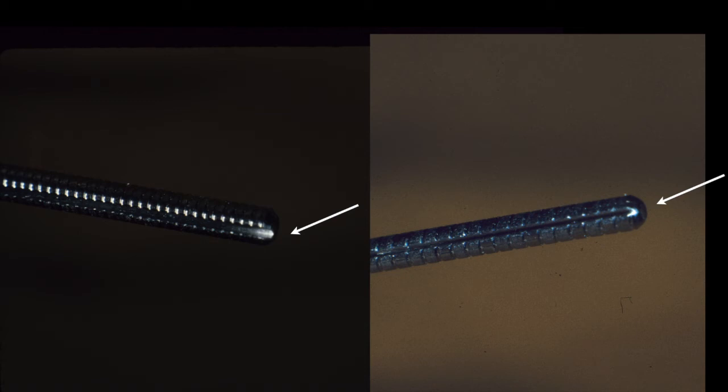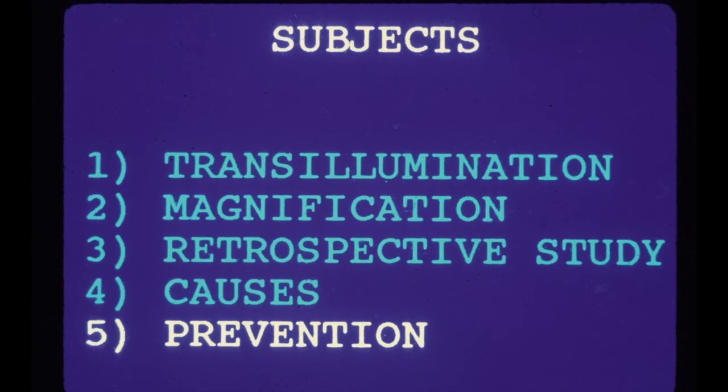When you press the post in gently, if it bounces back, the vent is not working. Of course, the viscosity of the luting agent has a lot to do with the necessity for a vent, but there is no point in taking a risk. Vent everything.